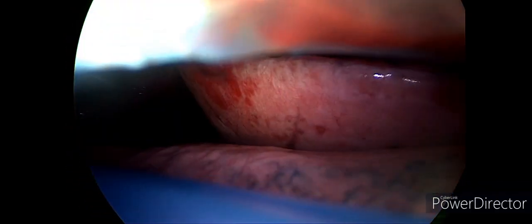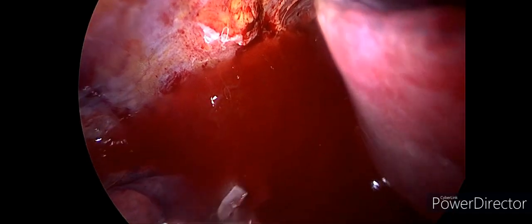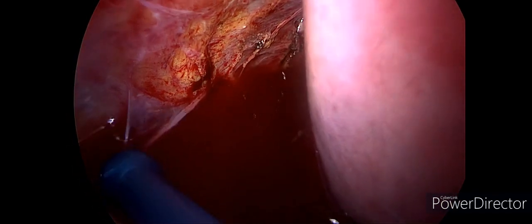So as you can see at the end, we're happy about our resections. There's no major or minor air leaks because of the peristrips. We're just waiting for the whole posterior segment of the upper lobe to expand fully, and that will conclude our surgery.